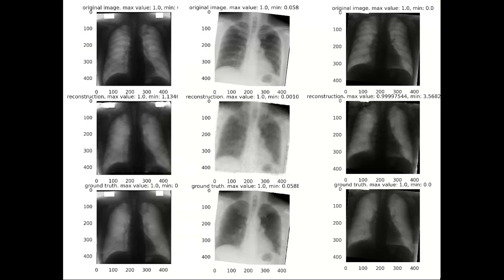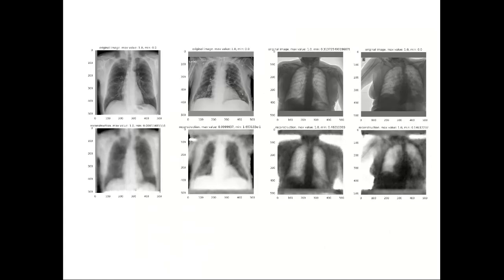Here you can see some examples of the performance of the trained model. Notice that the images presented here belong to the test set of the bone removal dataset, not the target dataset. In each column, the upper image is the original one, after applying some random augmentations to it. The lower image is the ground truth, and the middle image is the prediction of our trained model.